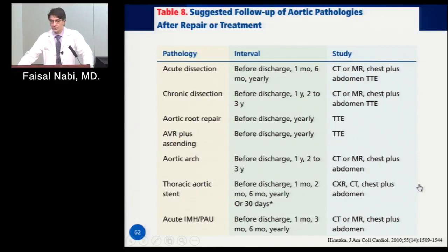and usually with some three-dimensional technique, because you're looking for complications, for expansion of the aorta, and the need for surgery. And the most important thing is, yes, you have radiation in the back of your mind, and yes, they have a higher risk of dying from some complication rather than radiation, but if you have a patient who's stable and you're following something, think about CMR, where you don't expose these patients to radiation over and over again.